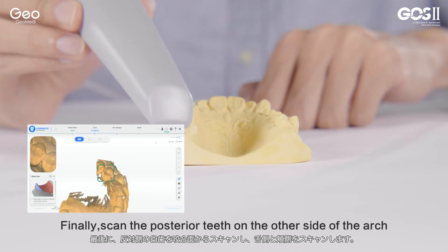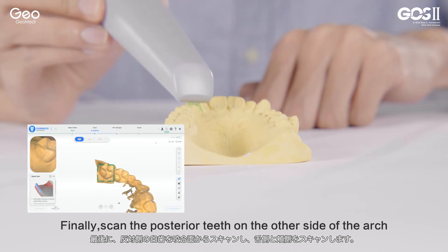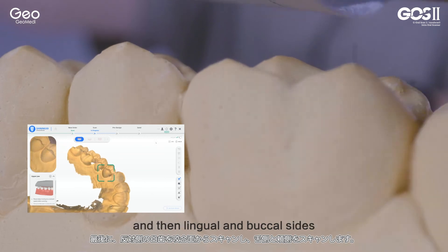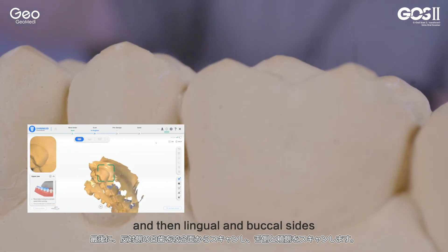Finally, scan the posterior teeth on the other side of the arc, starting with the occlusal and then the lingual and buccal sides.